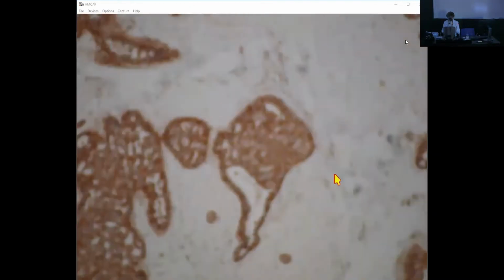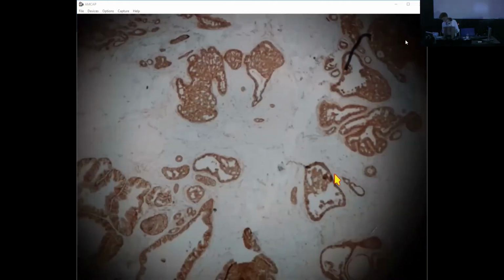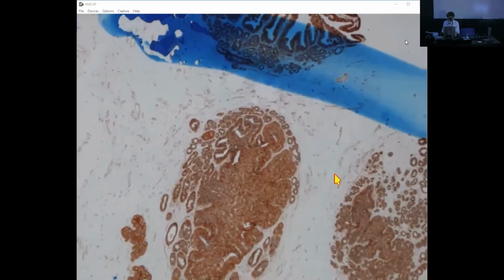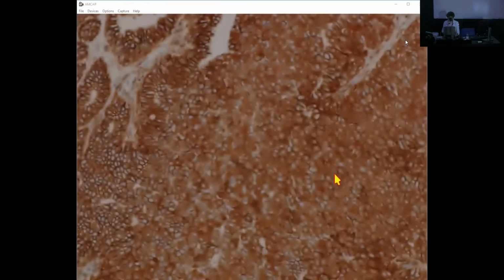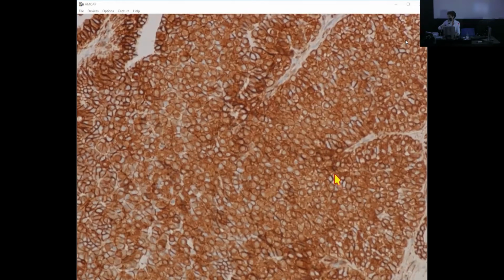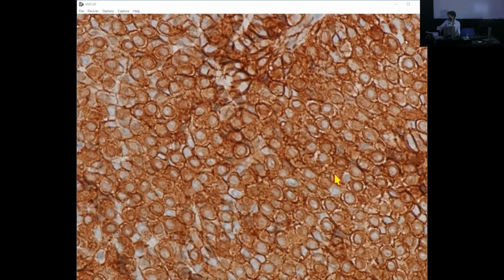And then, the area that I wanted to show you is somewhere here. In my experience, as I was saying before to someone, I prefer to do E-cadherin for in situ lesions and P120 for invasive, because sometimes it can be difficult to see the P120 positive cells in an in situ proliferation because they are less conspicuous.